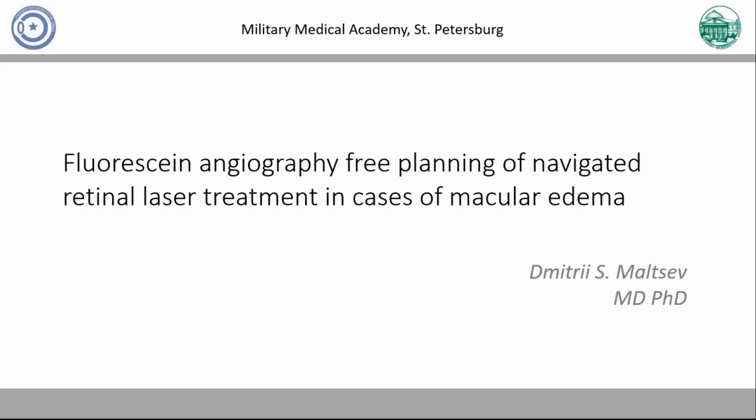Navilas provides the ability to overlay these diagnostic images onto the fundus image captured with a Navilas laser in order to plan and to perform an image-guided navigated laser treatment.